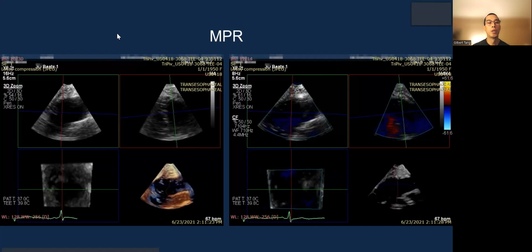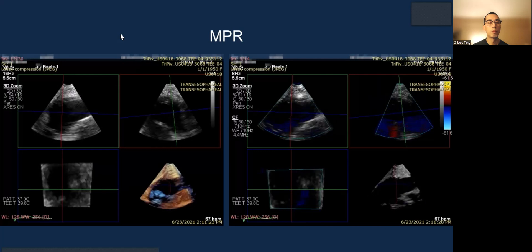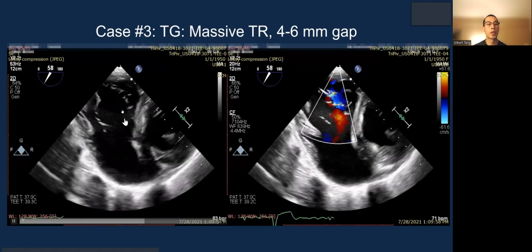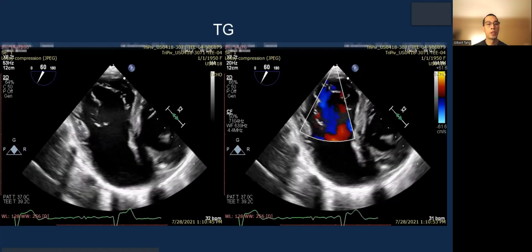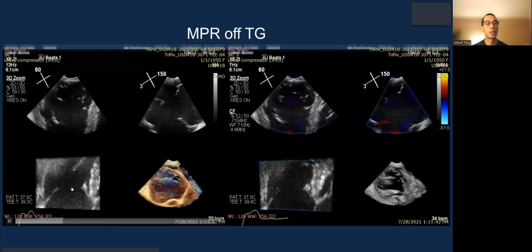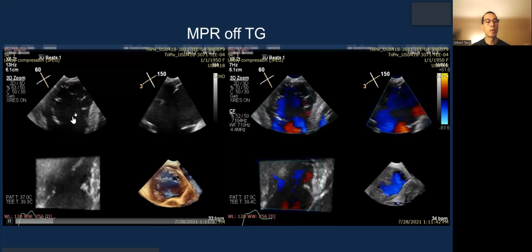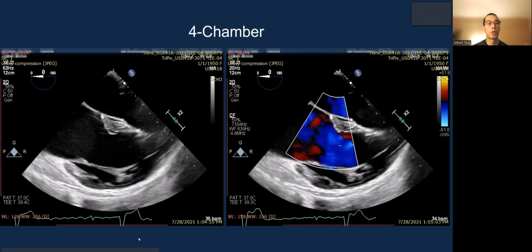Case 3: massive TR with a slightly wider gap. You can see where the jet is located, and the MPR of the transgastric looks fantastic — the leaflets are visualized very well here, making this a potential view for grasping. You can also see how the clip orientation will look, and color confirms the regurgitation.